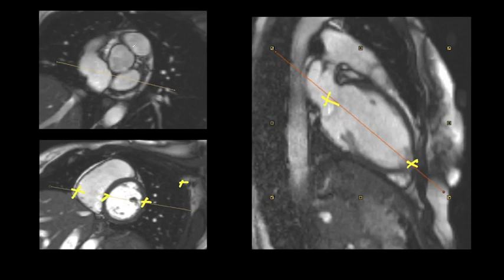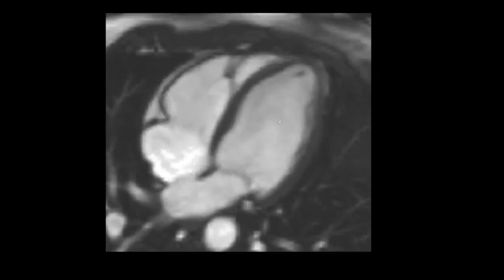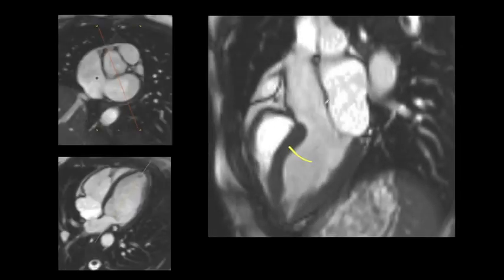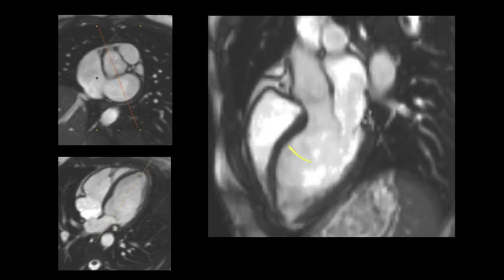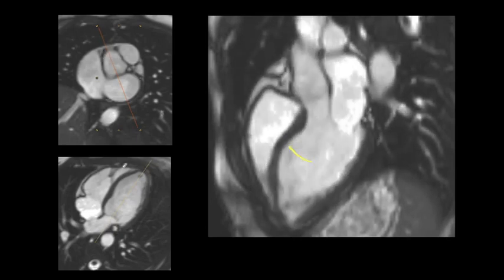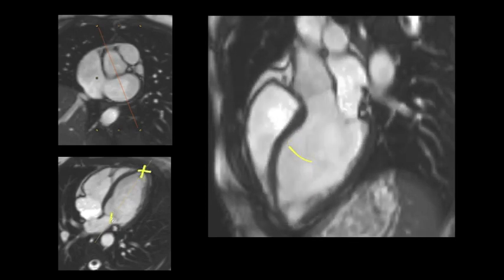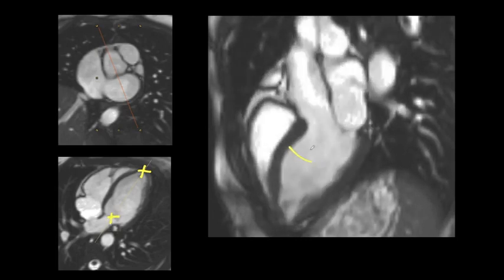You move up and down and make sure that the aorta and the LVOT are not part of your cut. And this gives you the true anatomical four chamber. The next slice is the LVOT, and to do this we use the slice we acquired from the first short axis where you can see the LVOT and you cross cut through it, and also you use your four chamber and you cross through the apex and through the mitral valve, and this gives you the LVOT.